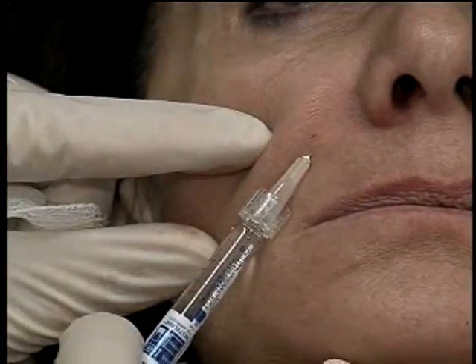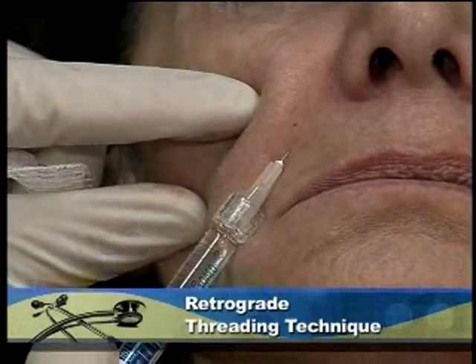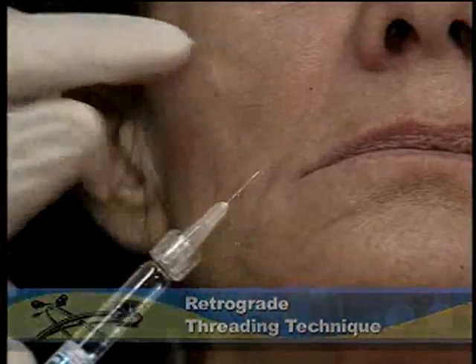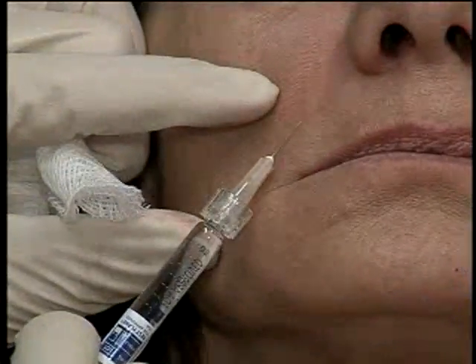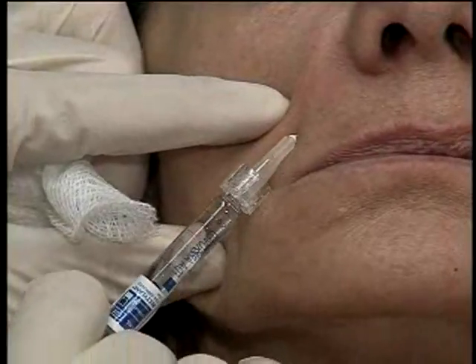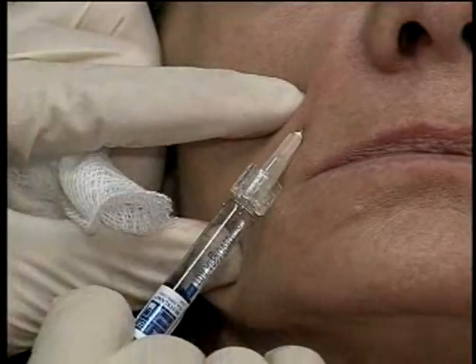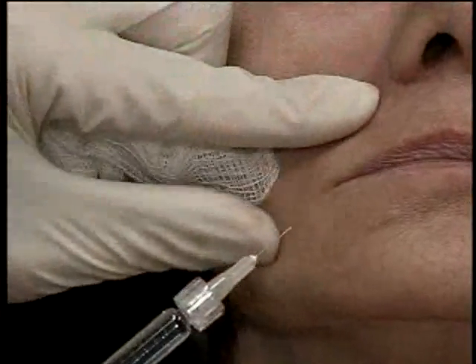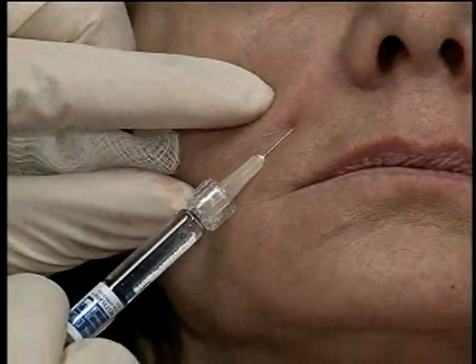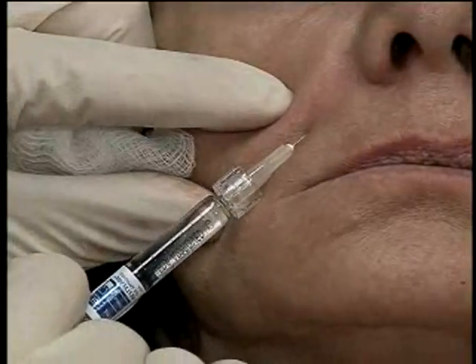Now if I was doing the threading method, it would be like this. And once again, this is a very popular technique. And that's the threading method. And I think it's an appropriate method. I just prefer the fanning. So now I'm going to go back to my fanning technique in the subdermis. I come back up here where I threaded before, so I can fill in just medial to the fold.